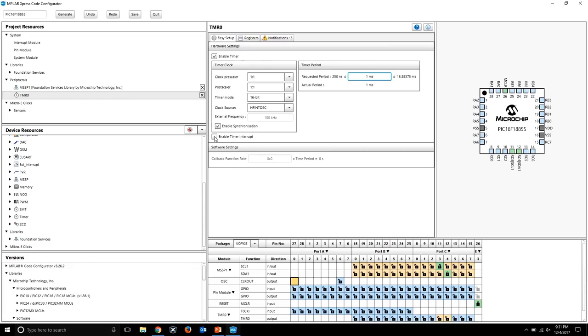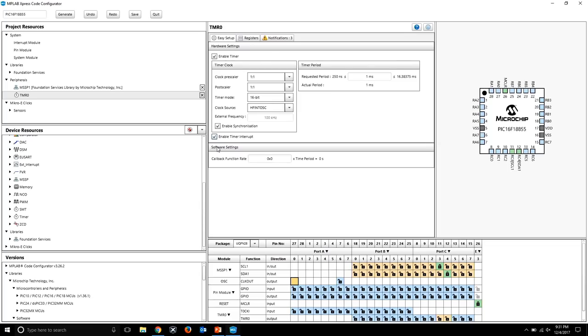Now, they said set up the interrupt of timer 0, right? So obviously we have to check the box and enable the timer interrupt. That's a simple mistake, and it's something you guys have to pay attention to. Make sure that box is checked, yes. Otherwise, your interrupt will not work, obviously.